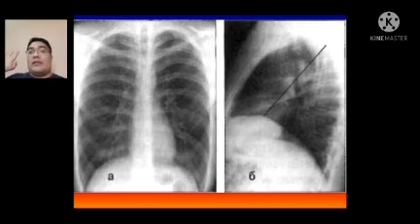This is the normal X-ray, using the X-ray tube and a receiving part. In classical X-ray, it's an X-ray film. In digital X-ray, it's a dosimetric detector which gives information to the computer, and after that the computer gives the information to us, and according to this picture we can make our conclusion and the diagnosis of diseases.